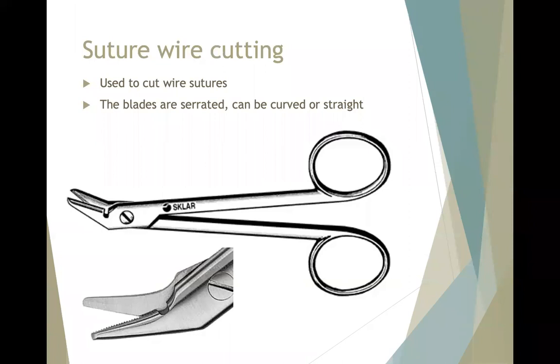When we're removing wires, specifically what I'm thinking of is jaw reconstructive surgery. If a patient does have a broken jaw from trauma, we see this a lot, where they can have trauma to the jaw and a break in their mandible. So we can actually place a wire completely around the mandible to hold it in place.